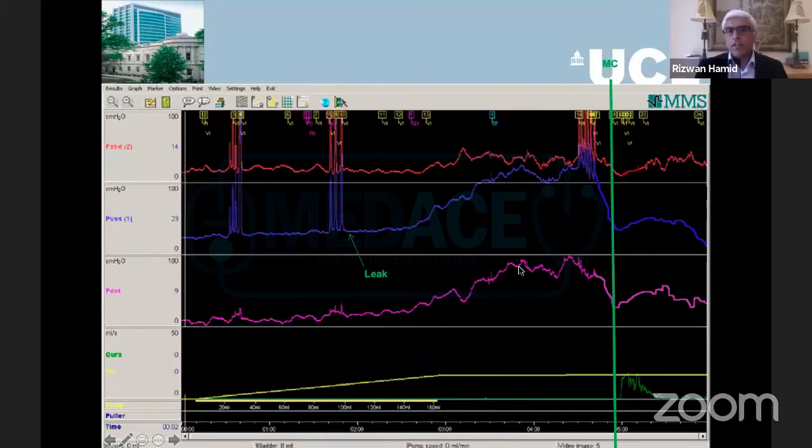Generally, what one tries to do in urodynamics, good practice is that you do not give the voiding command unless the pressure has started to come down. Otherwise, if you get the patient to pass urine on an unstable contraction, then the pelvic floor might be contracted and you might not get as good a result as you want.